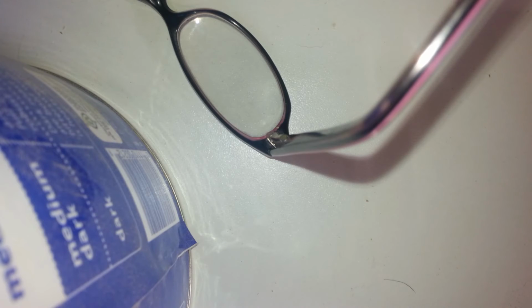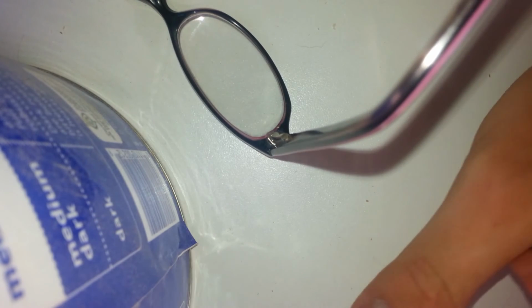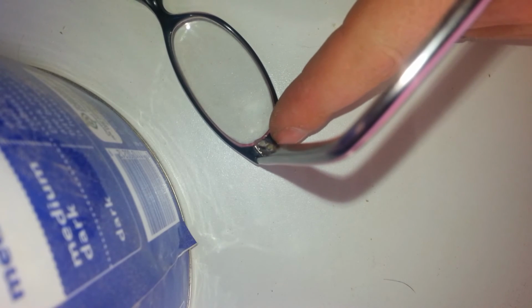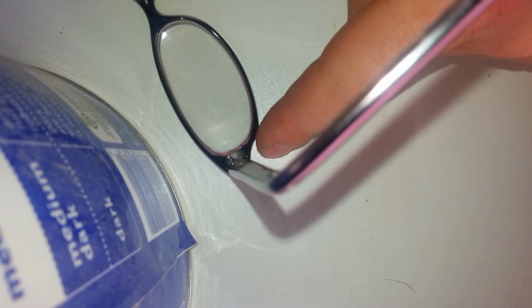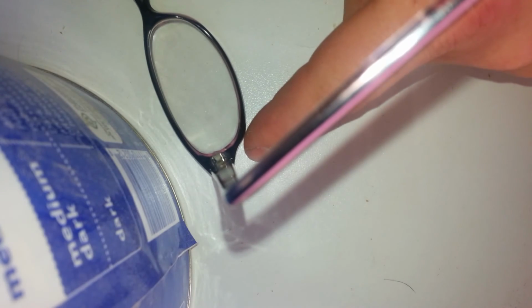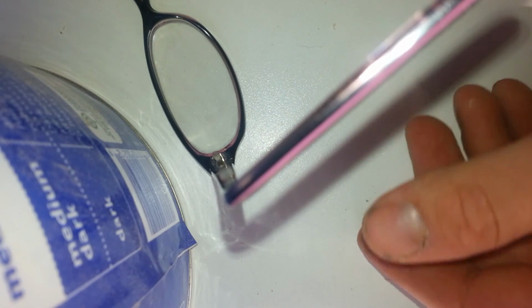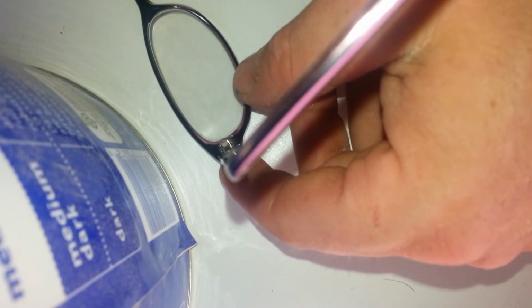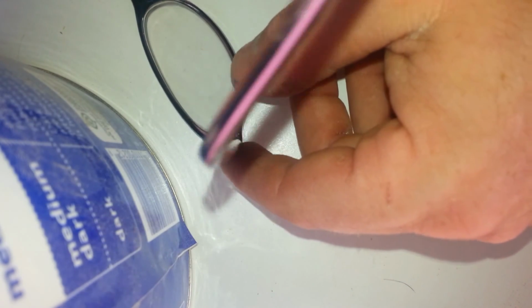You know, for a little while, but all in all, you need to get it repaired with your eyeglass manufacturer. But what this does is doesn't void your warranty, at least that I know of. We're not putting any glue on it. We're just heating the plastic back up and slipping it back into its joint.